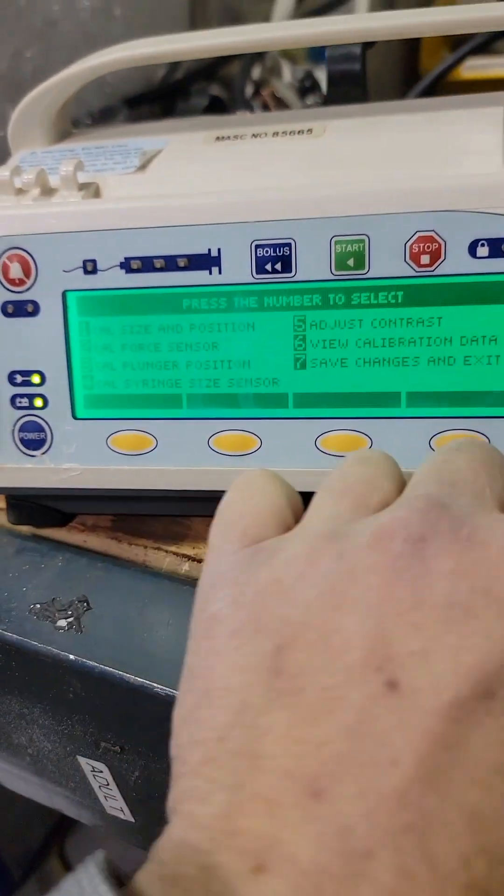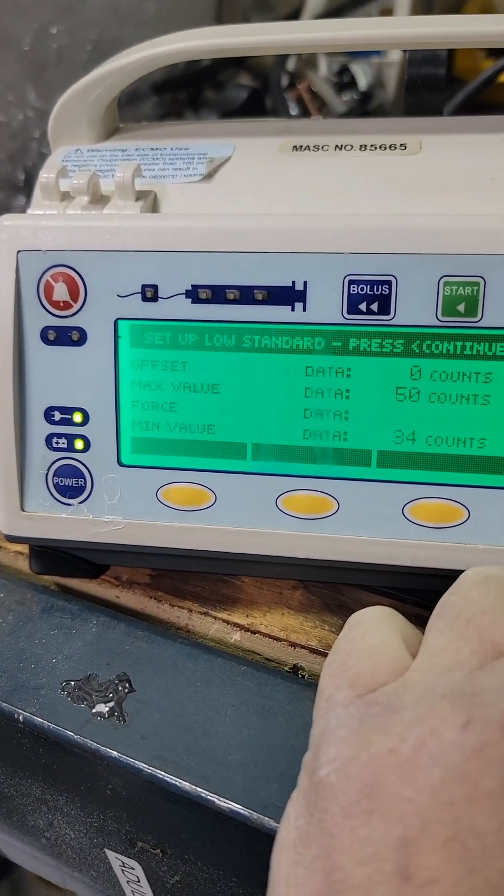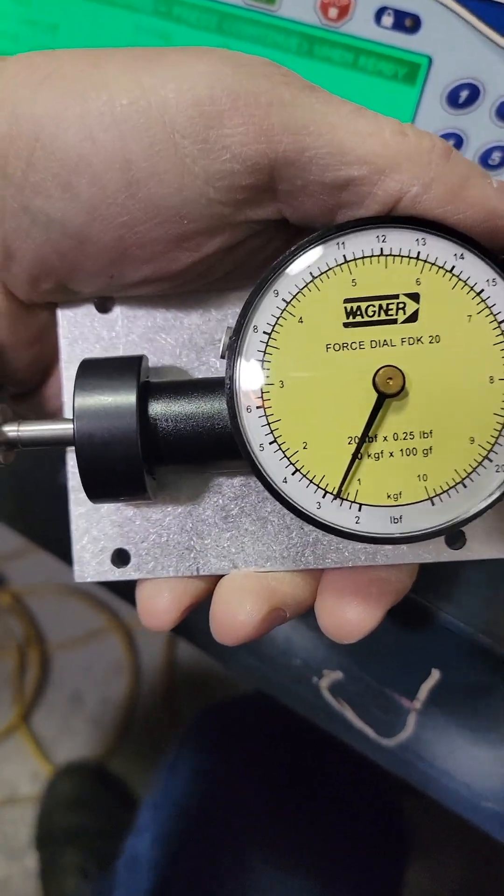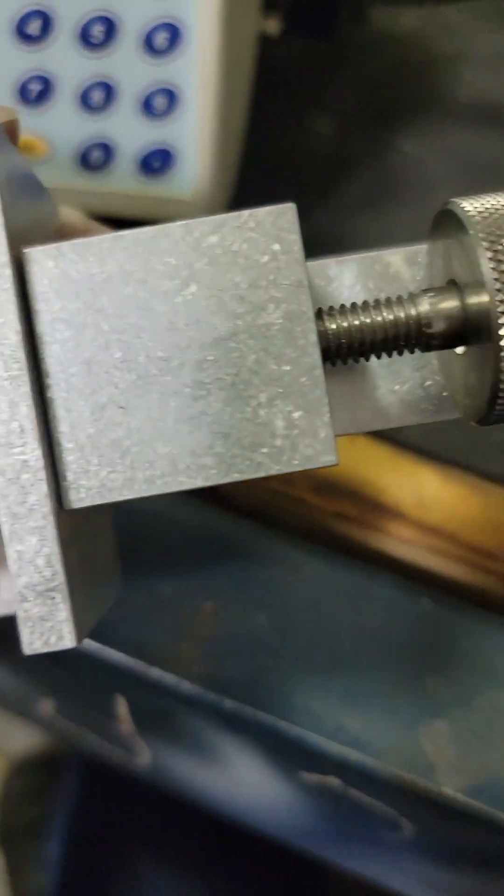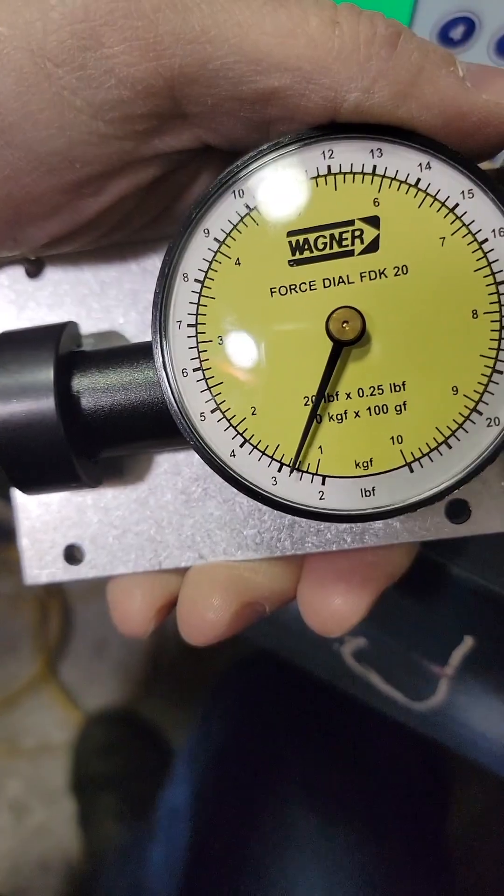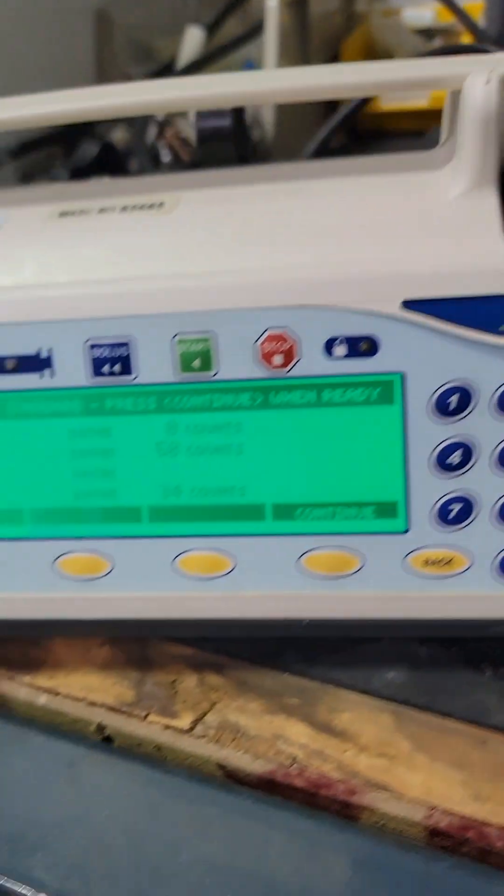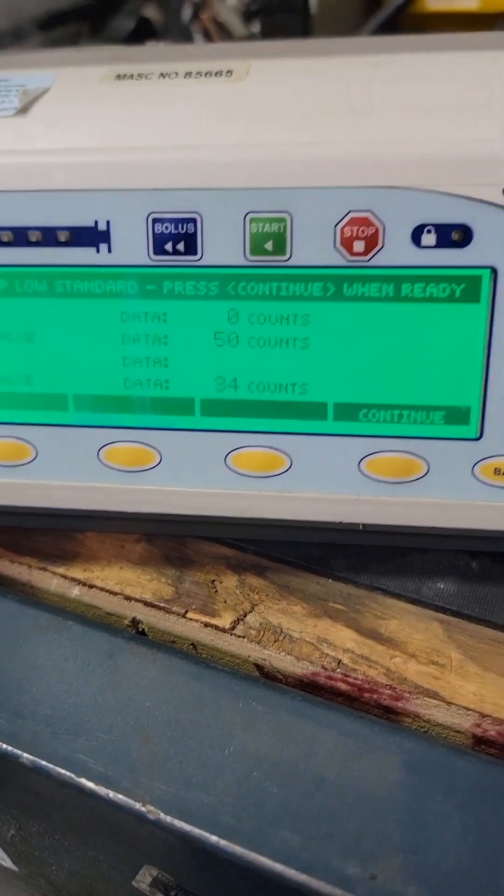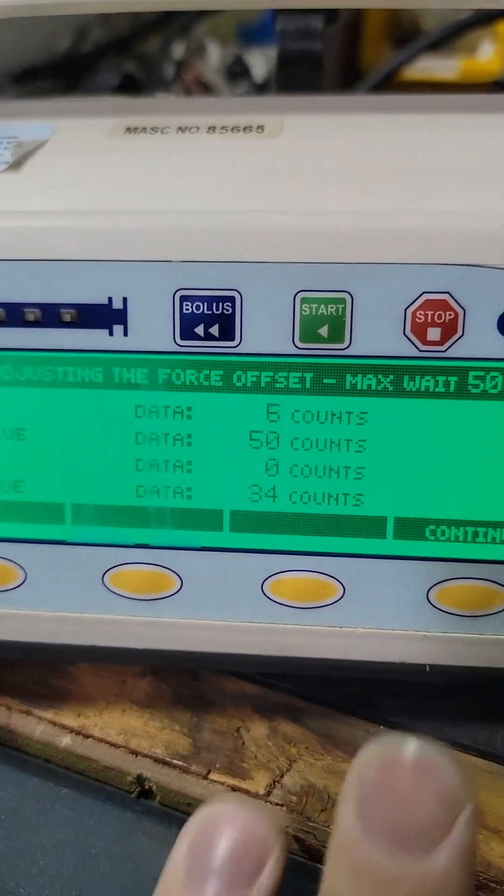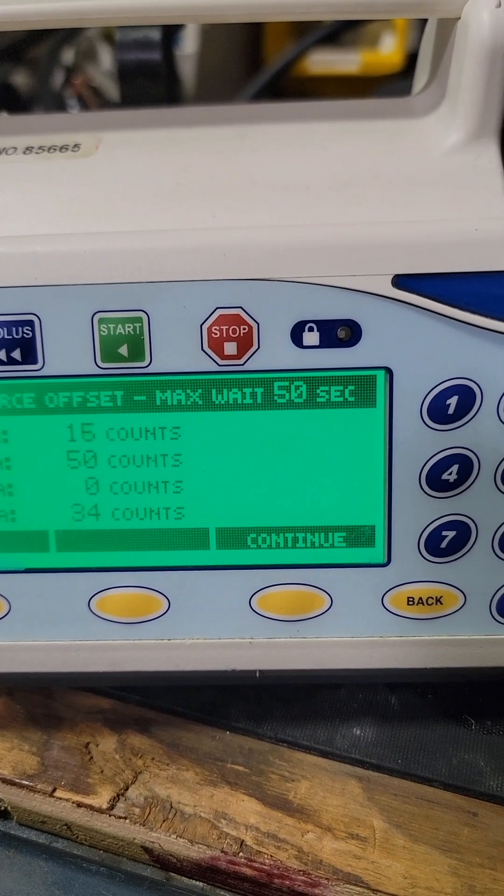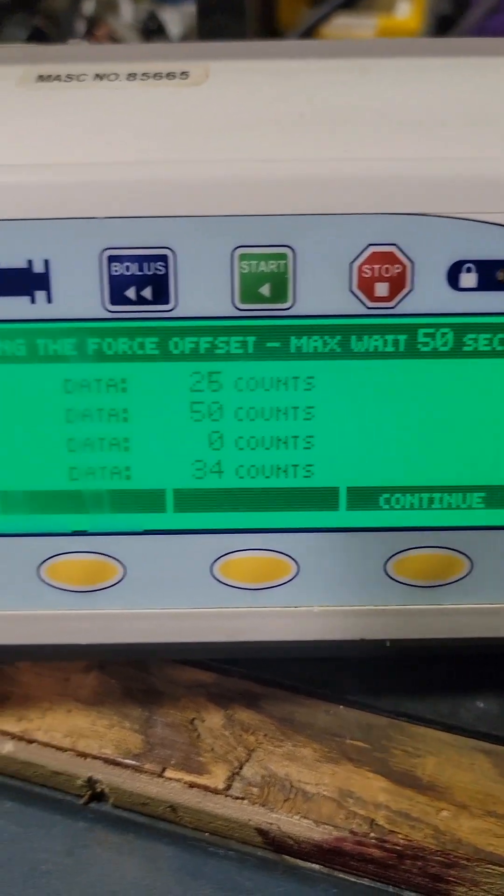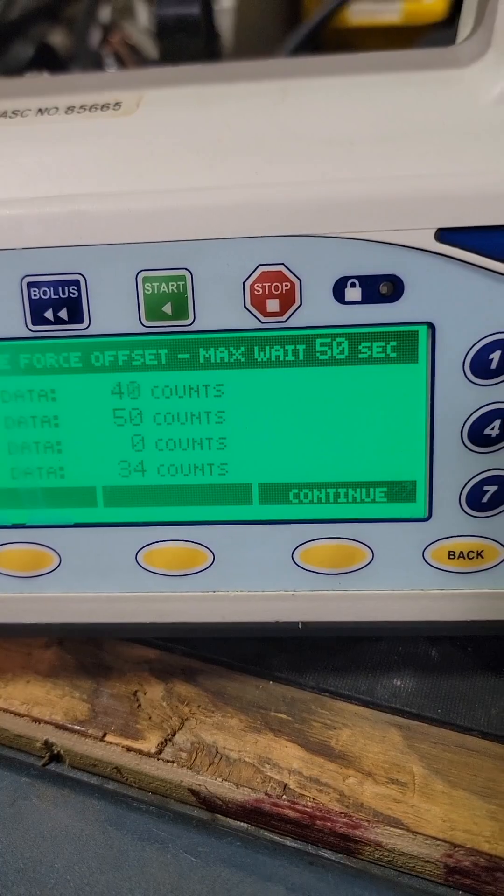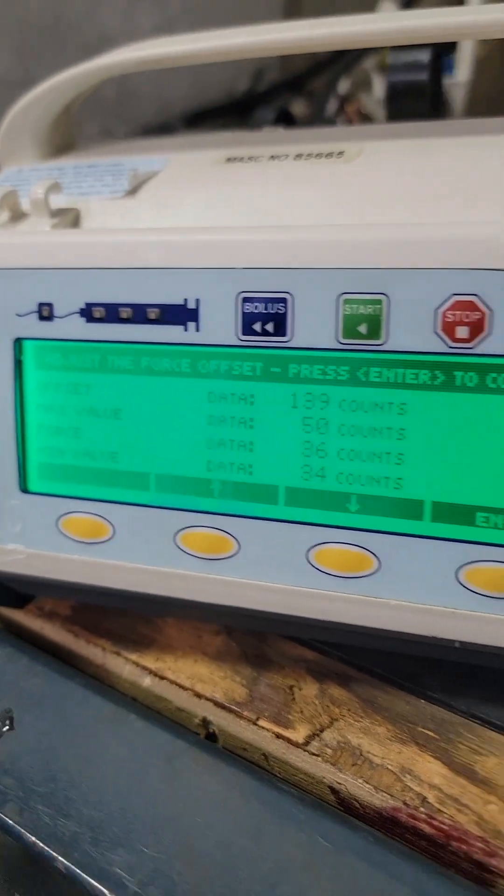For this part, this is our force dial we're going to use to calibrate the force sensor. There's nothing in there, no syringe, hit zero. Let it do its zeroing process, it takes a little bit.